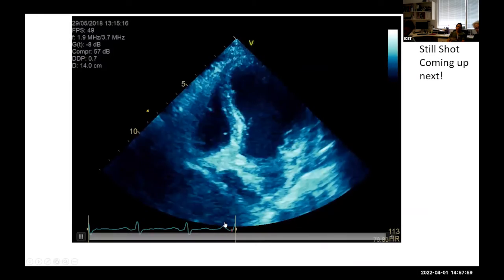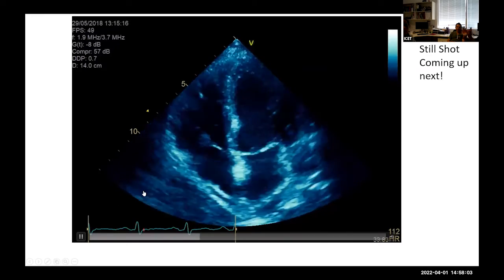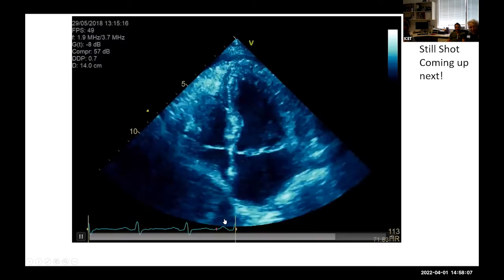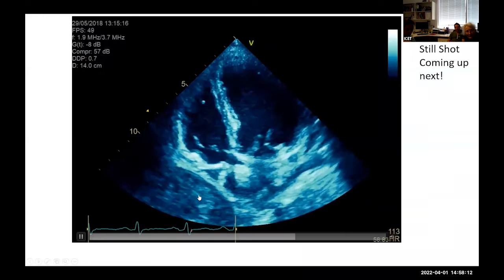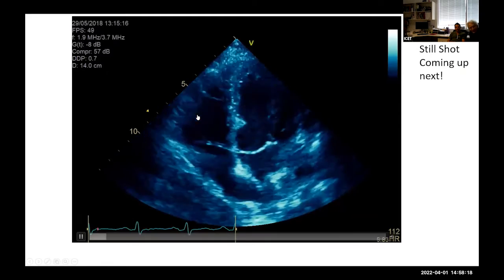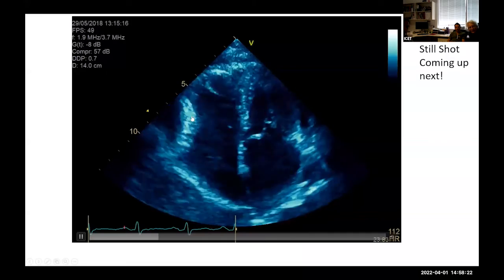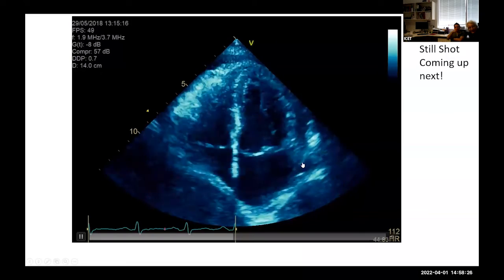I don't know what this thing going on here is. This is something. This is the atrial collapse. But no, what's that? Is that collapse or is that a lesion? I don't know about that, but I think the atria is collapsing. Yeah, the atrium is definitely collapsing with the effusion. I think the ventricle is also collapsing as well. The left side doesn't appear to be as much.